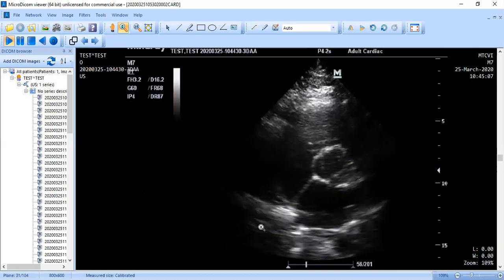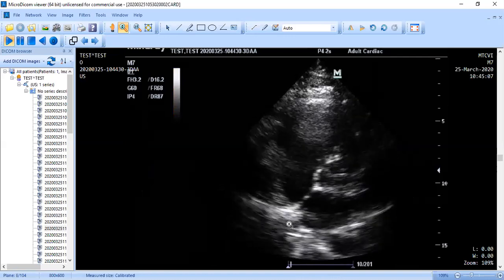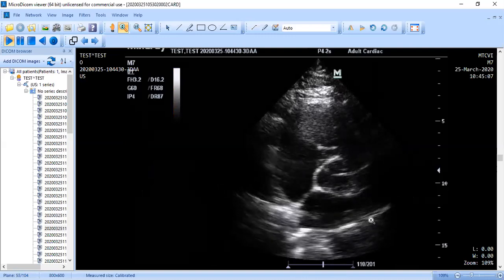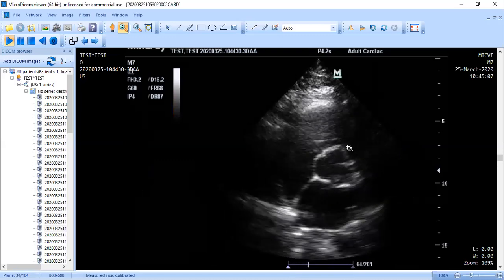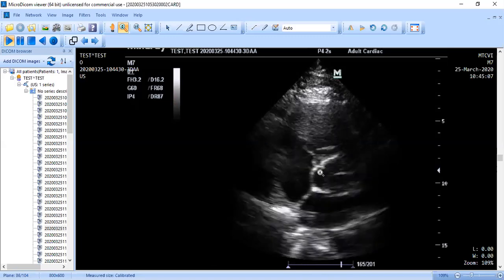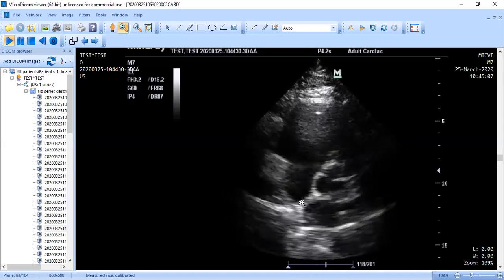Okay. We move forward with our parasternal short axis base view here. Now we see a lot of different structures here. As we know, the main thing we're focused on first is seeing that aortic valve. We want to see 3 cusps to the valve. We want to see our right, our left, and our non-coronary cusp. As I've said, the non-coronary cusp is always going to be closest to the interatrial septum here.